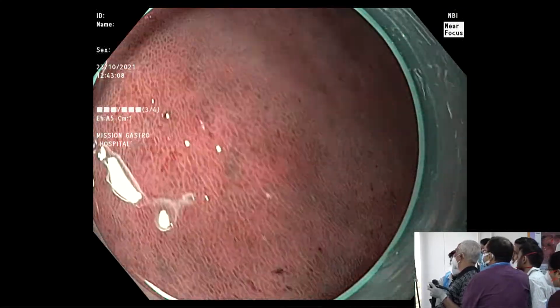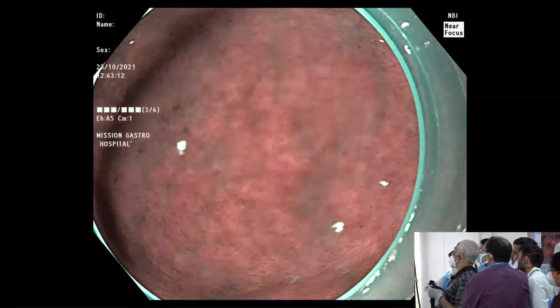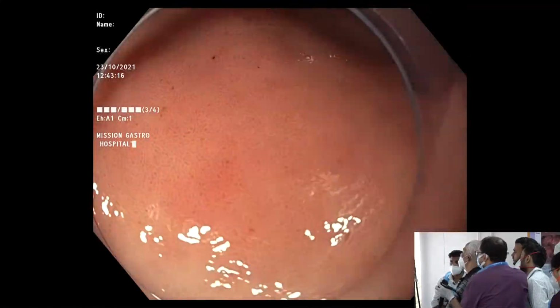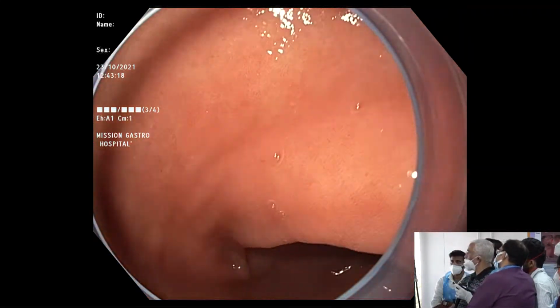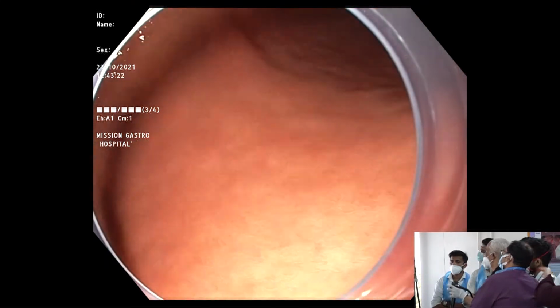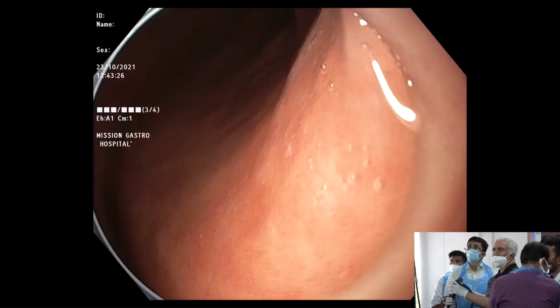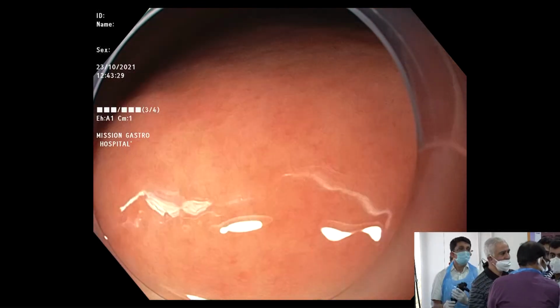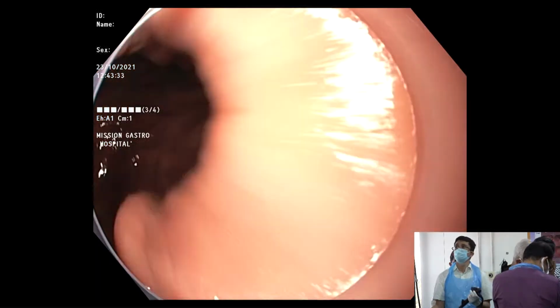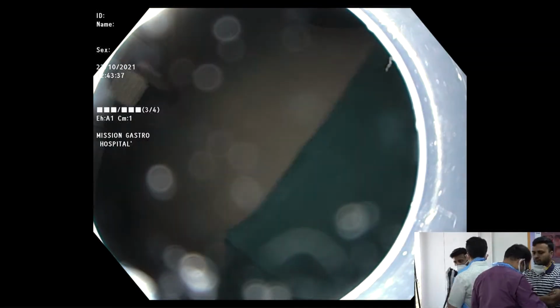There's not too much of atrophy. There is just maybe some H. pylori gastropathy, but I can't find too much of atrophy here, at least from whatever I see. But esophagus, I think, is not. H. pylori related. I think I may have some slides to show you.